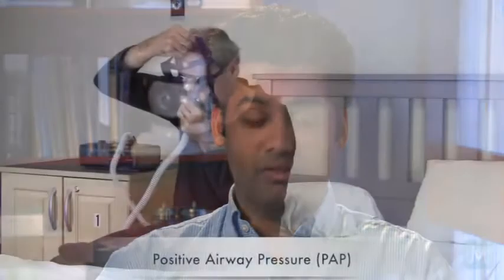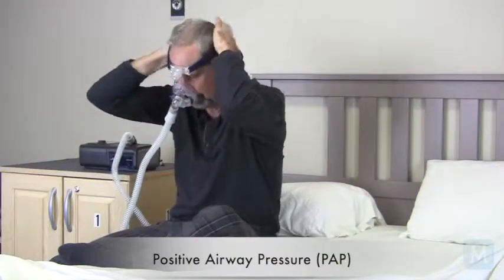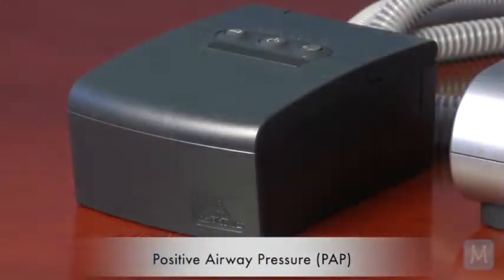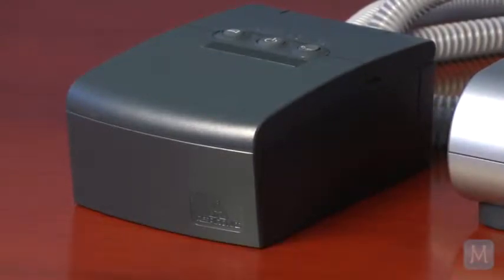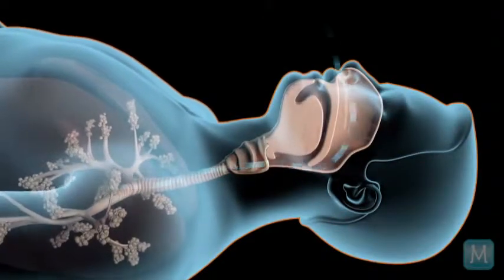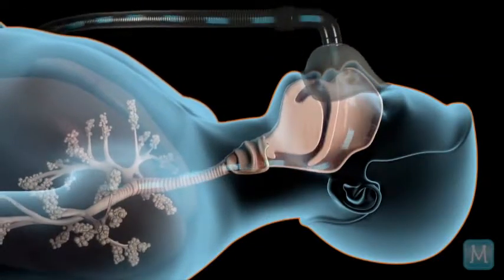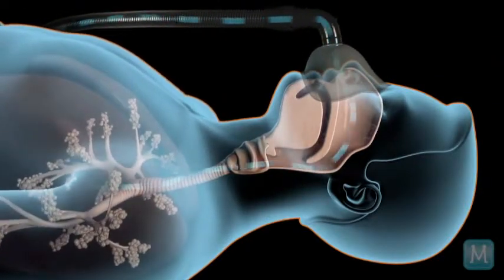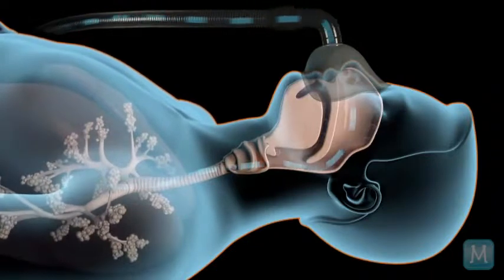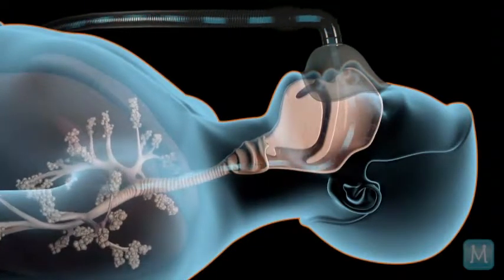So one common treatment for sleep apnea is a positive airway pressure device. The way a positive airway pressure device works is that there is a small box about the size of a bread box you plug in the wall, which generates air pressure in a very quiet way. Air pressure comes out of the machine. It goes into a hose to a mask that you wear around your nose and mouth. And that air pressure will travel here to behind your palate and your tongue, and that will help open up your airway. And it's usually done at a very low pressure.